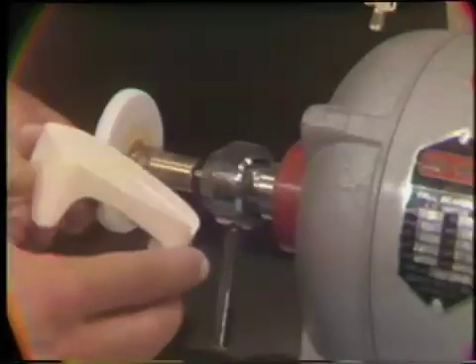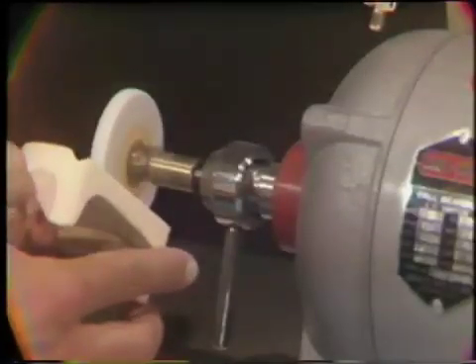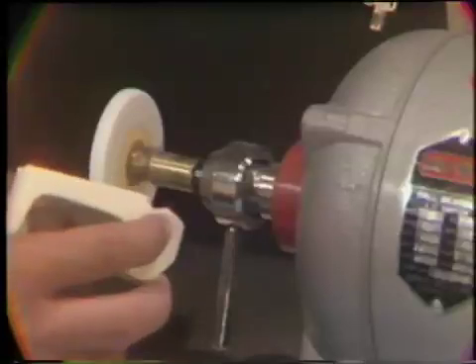Use the fast cut stone on the dental lathe to cut keyways in the base of the mandibular master cast.